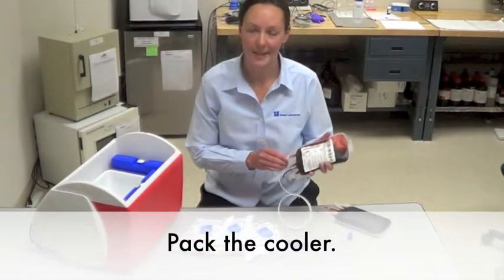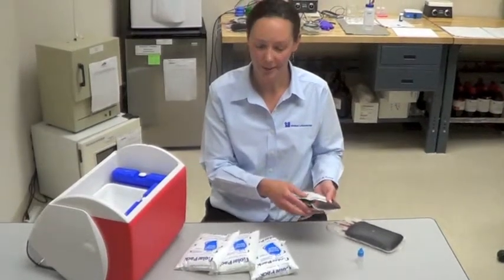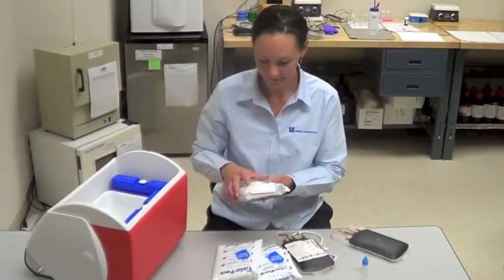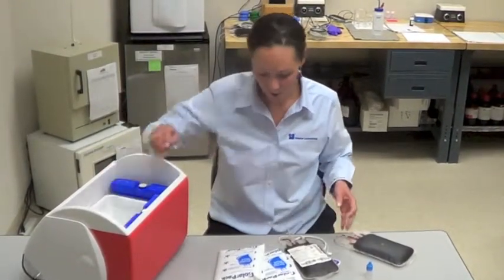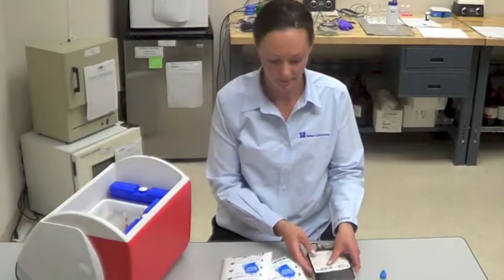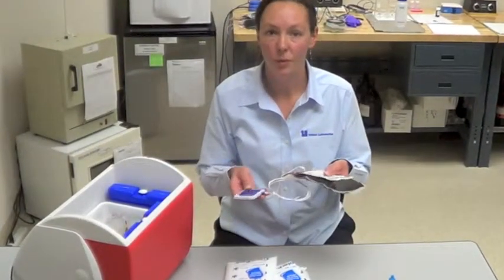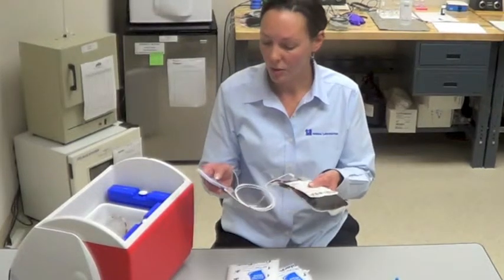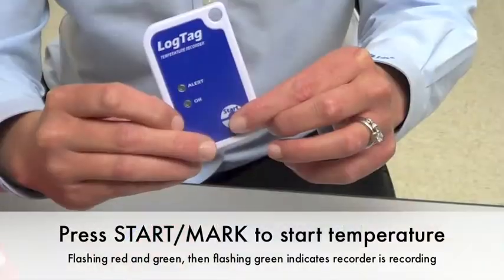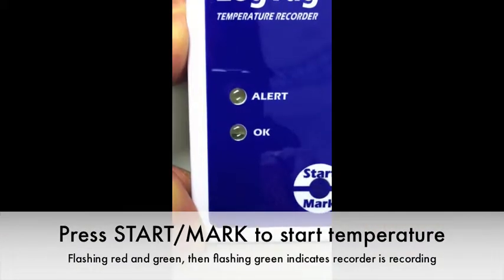After you've inserted the bag sealer probe and attached the temperature recorder, we're ready to pack the cooler. It's a cool bag on the bottom, a bag of blood that doesn't have the probe in it, and the bag with the probe in it. Make sure you push the start mark button and see the green light flashing to ensure that it's recording the temperature.